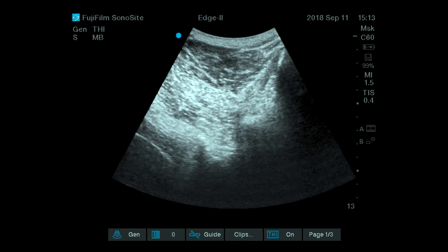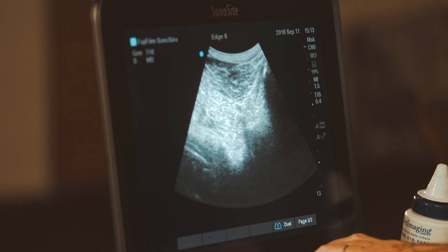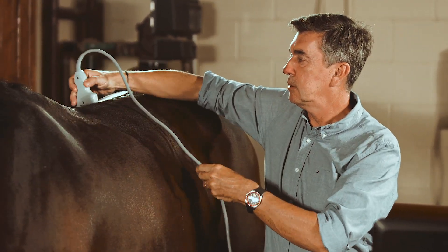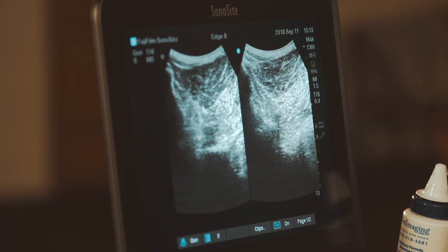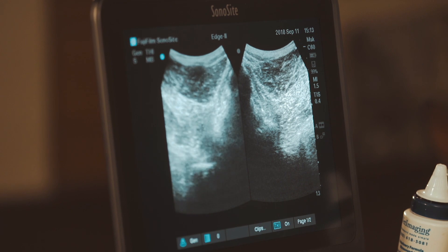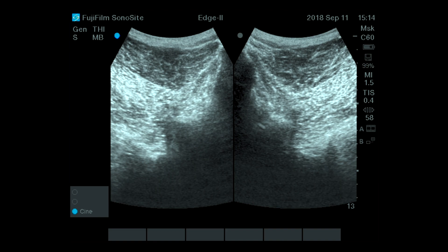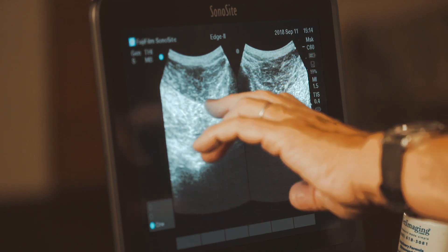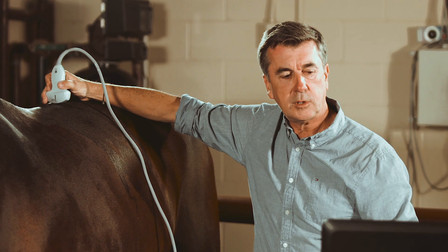As you go more caudally, you can build an image combining both sides. By moving to a dual screen, I can show the right side and the left side together to see one full vertebra. You're going to see the two longissimus muscles left and right, the multifidus muscle with a darker line between them which is the deeper fascia, and the articular processes on both edges, left and right.